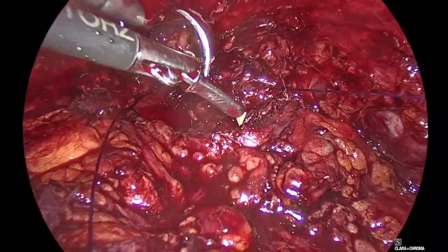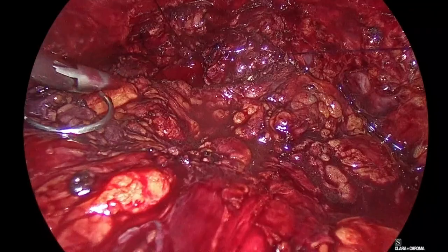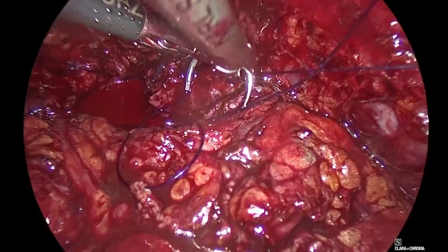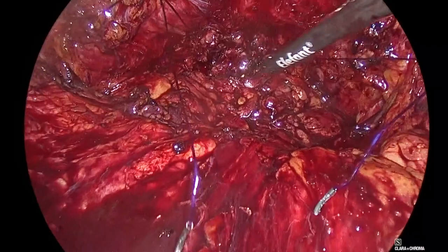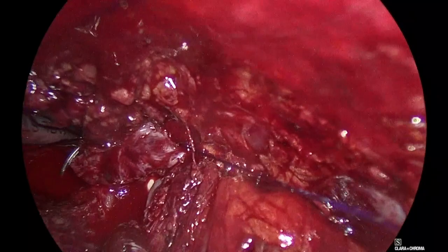Let me see if we lock again here. It's probably locking, so let's take this on this side. Let me see. No, it was not locking. Come in. Show me. Go back. Good. Check your catheter. Aspirate, Panagiotis, in there. Good. Needle. Okay, come in. Aspirate inside. And go. Padeli, not so close. Left side.